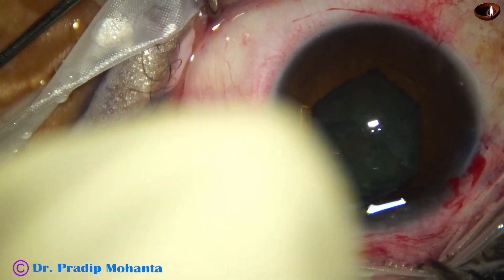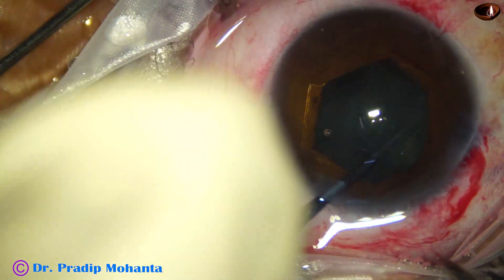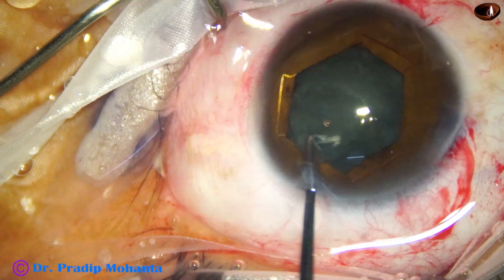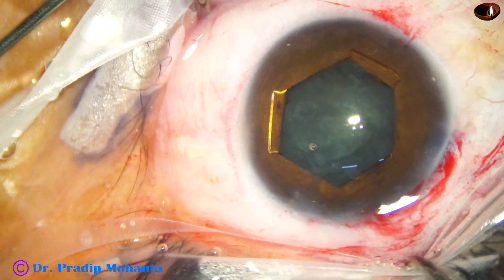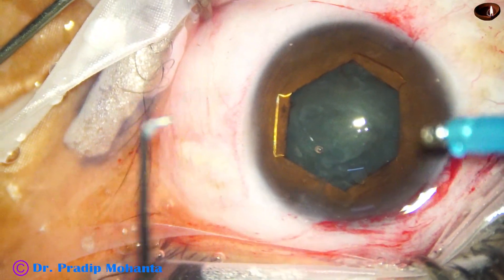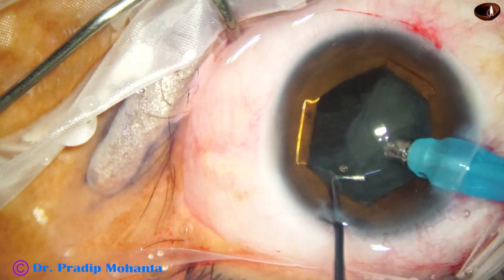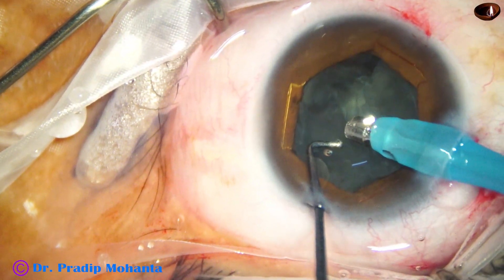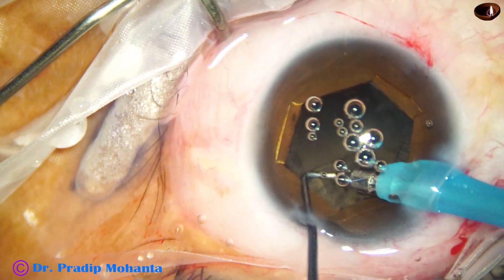Hydrodissection has been done. This is a nucleus sustainer used for nucleus cutting by a pre-chopper. Trying to rotate the nucleus, but it was resisting movement. And now I take the PHACO handpiece and go into the anterior chamber, trying to aspirate the lens matter. But unless you use a little bit of power — about 20% ultrasound energy — it's difficult and very slow. So using some power, and very quickly it is aspirated.